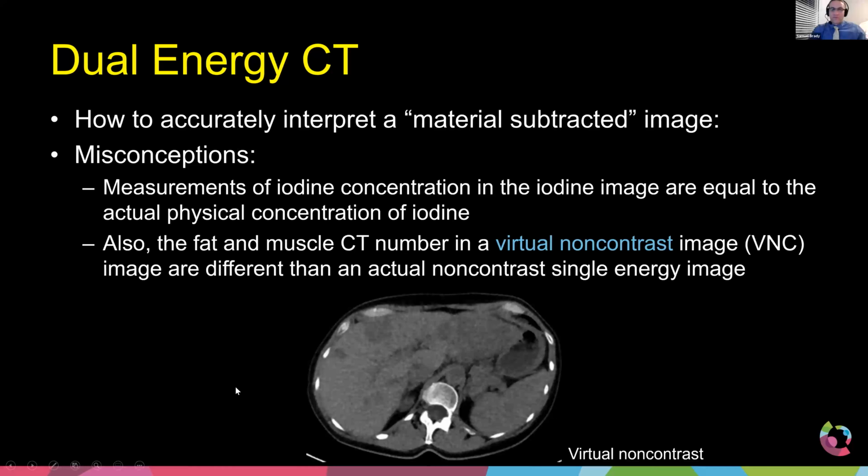For example, the liver itself, when you infuse it with iodine, every voxel is going to have some soft tissue in it, might even have some fatty uptake in it locally, and it'll have iodine. So when you reconstruct it, the appearance is a combination of all of those atomic numbers, all of those materials in one. And so if you simply subtract one out, it's obviously going to look different.